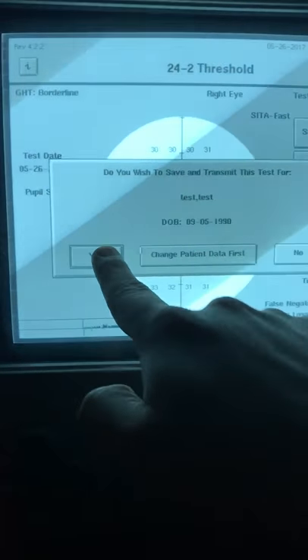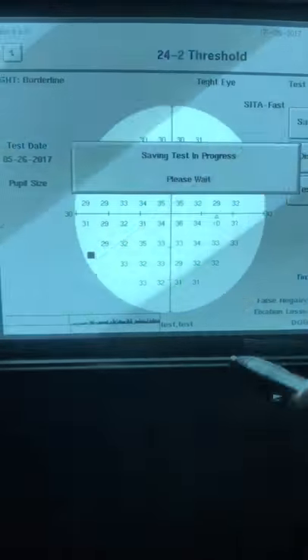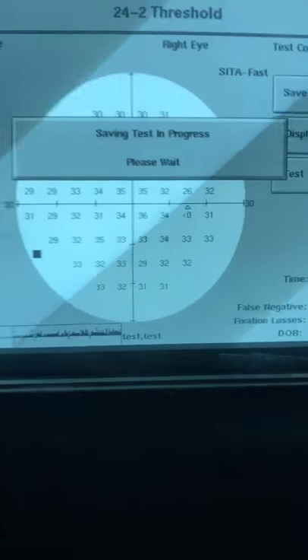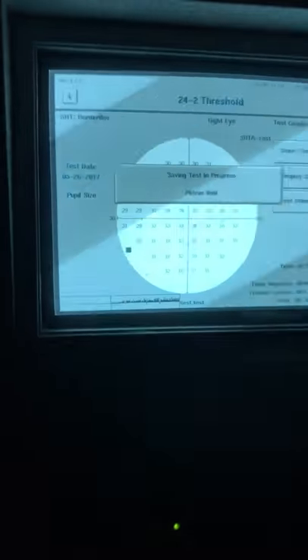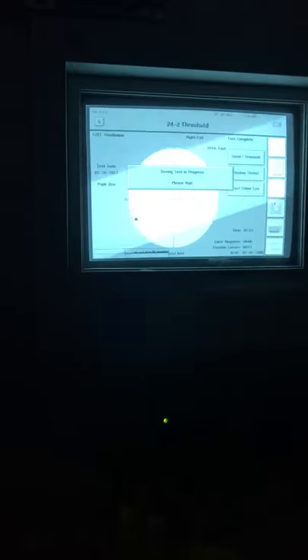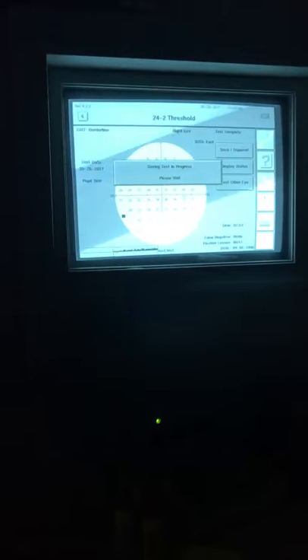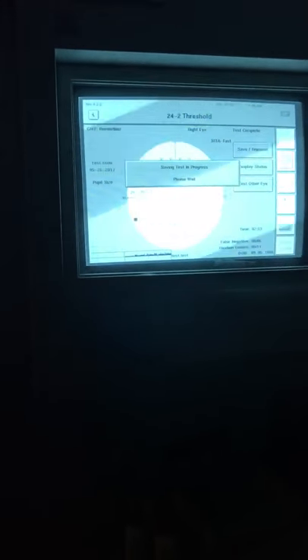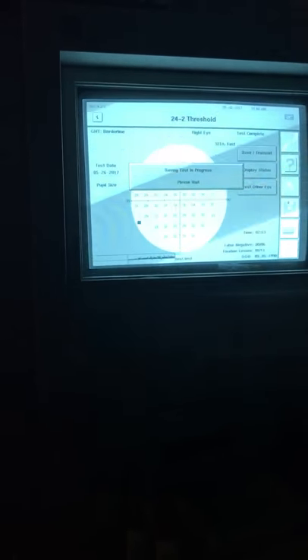We're going to save this test. That zero right there is the blind spot, where the optic nerve lies. We'll save the test first into the hard drive, and then do the same thing for the left eye.